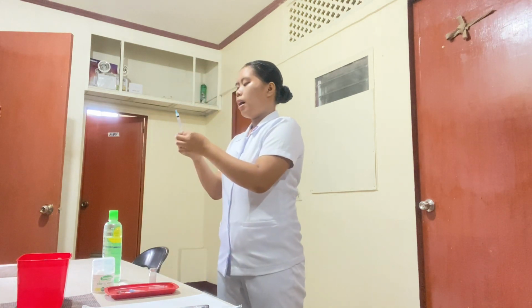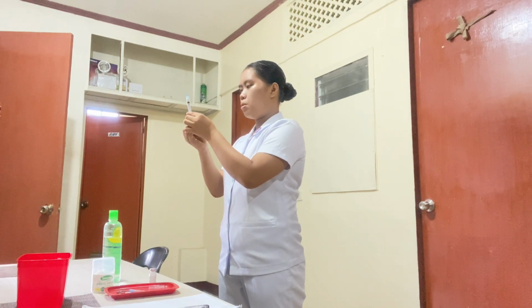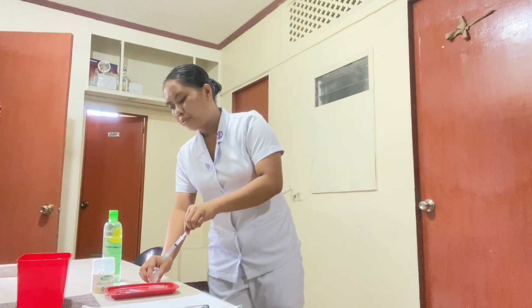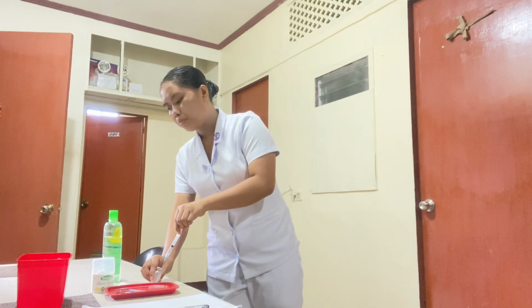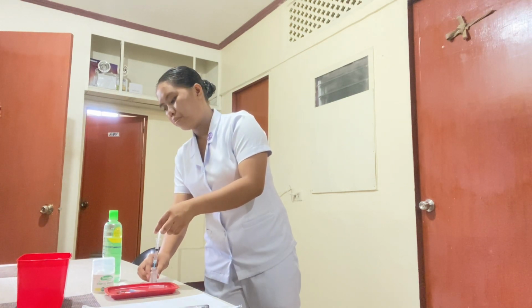Then withdraw into the syringe an amount of air equal to the volume of the medication to be used. Then carefully insert the needle tip into the upright vial through the center of the rubber cap. This is to maintain the sterility of the needle.